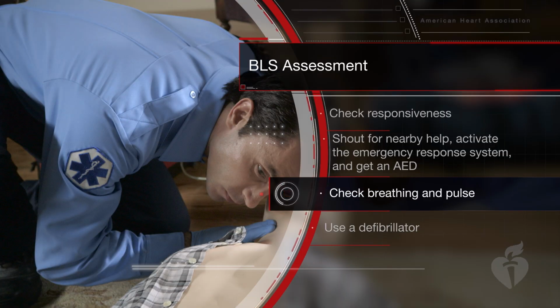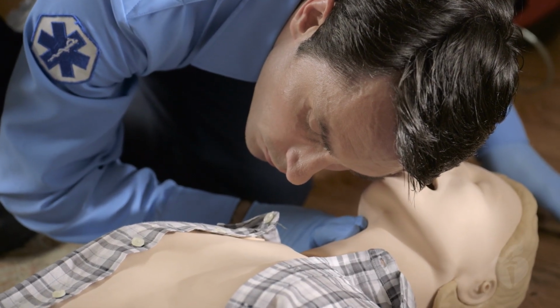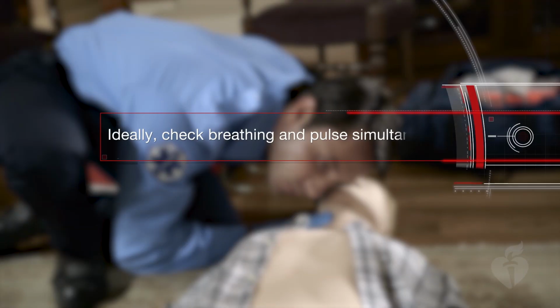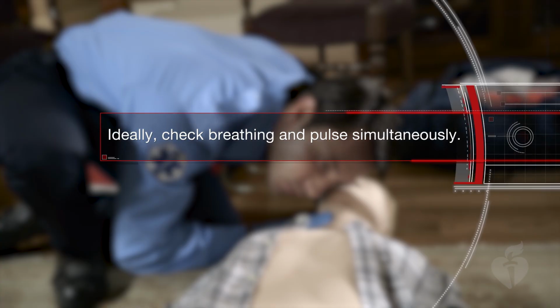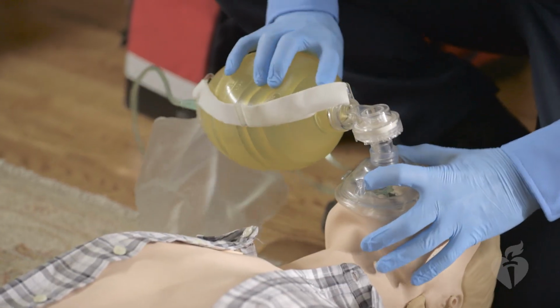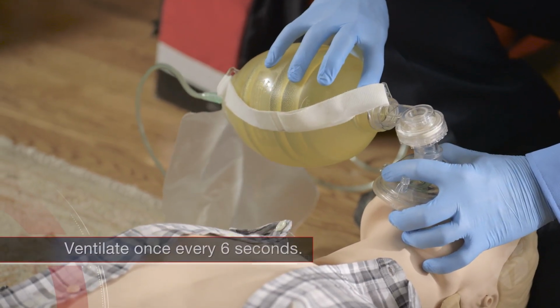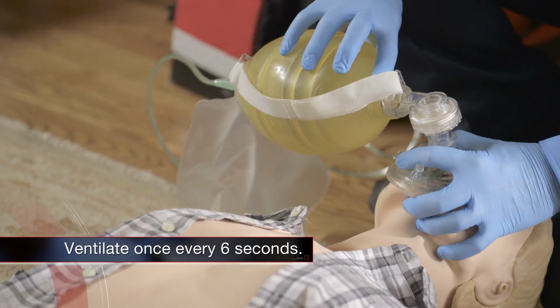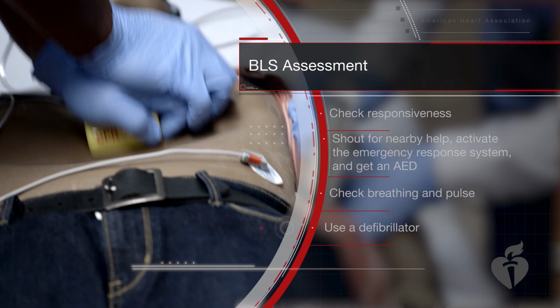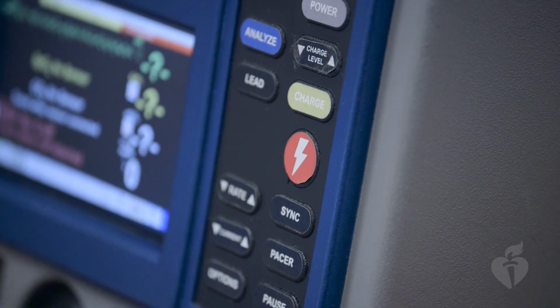Next, check breathing. Scan the chest to detect if breathing is absent or abnormal. Check for a pulse. Ideally, you should check breathing and pulse simultaneously. If you can't feel a pulse within 10 seconds, start high-quality CPR, beginning with compressions. If you determine the patient is not breathing normally but definitely has a pulse, bypass chest compressions and support the patient by ventilating once every 6 seconds. As soon as possible, attach an AED or defibrillator and, if indicated, deliver a shock.